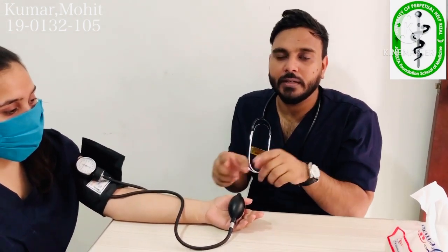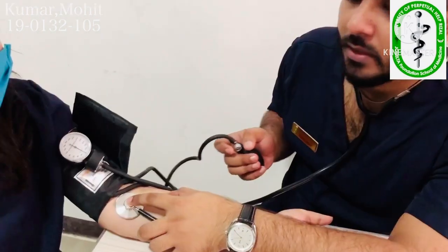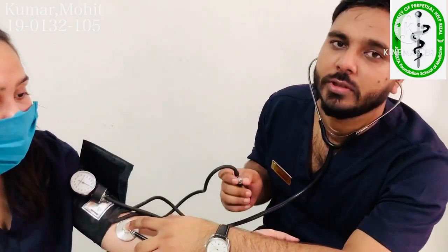Why did we take this reading first? Because we don't want to discomfort the patient with higher pressure. What we do now is add 30 millimeters of mercury to that reading. Our reading was 110, so next time when we take the proper reading, we inflate up to 110 plus 30 — that is, up to 140. We are back after 45 seconds.